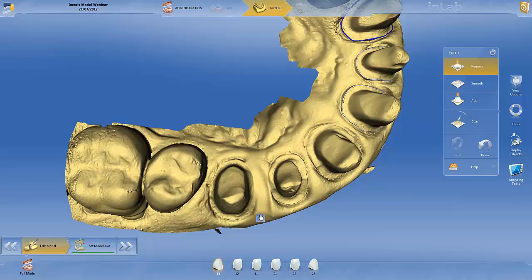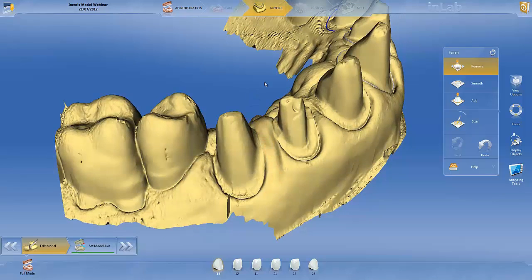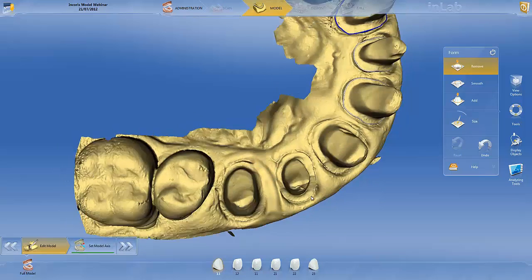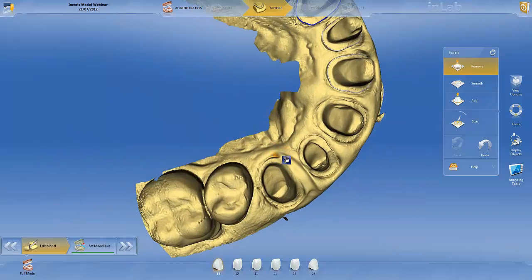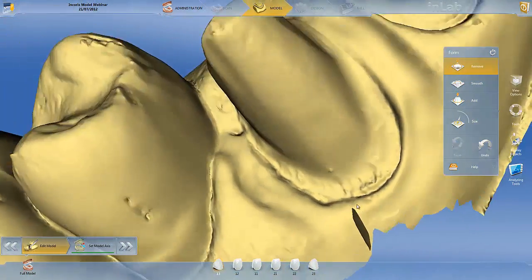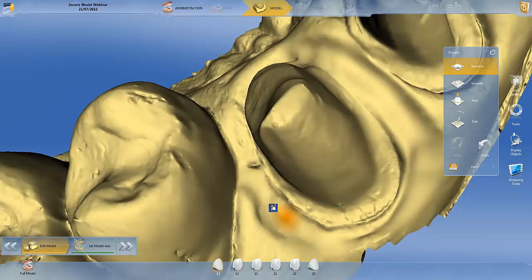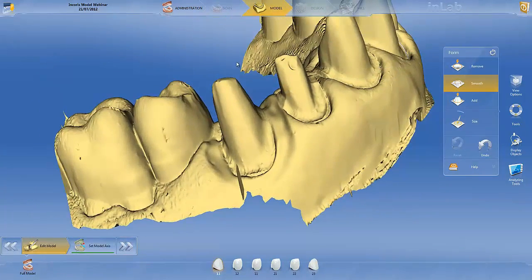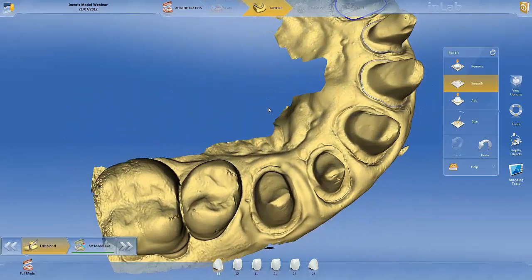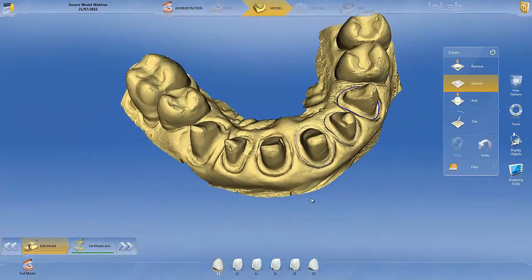Generally speaking, when I do that, it's the same as when we pour a second pour to check the contact. I export the file and I do that in an individual folder. Also, you want to make sure your solid model would fit in the block. So you can do that for the rest, and you would have a solid model that you don't need to touch or adjust anything with it, and it's ready to be used for checking your contacts.